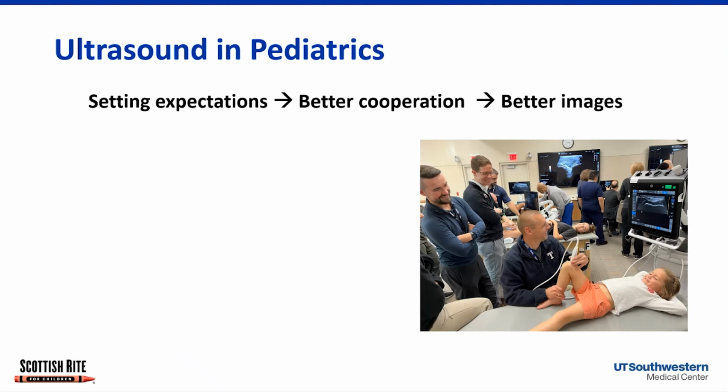So how does this apply to pediatrics? Well, you know, kids are a little bit different than adults, right? So it's important when you're scanning the kids that you wanna set proper expectations so that you can get better cooperation from the kids. And that leads to what? Better images, right? So you can make better diagnoses or do better treatment for these kids. All right. So their biggest question is usually, is it going to hurt, right? When I'm going to the doctor, am I getting a shot, right? Is this going to hurt? No, it's not going to hurt, right? That's we tell kids, hey, we do this on babies, right? Before they're born. That's how you know it doesn't hurt at all.